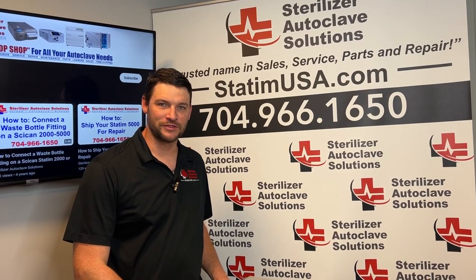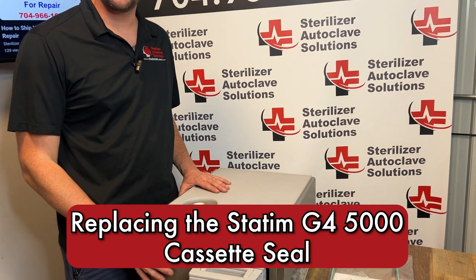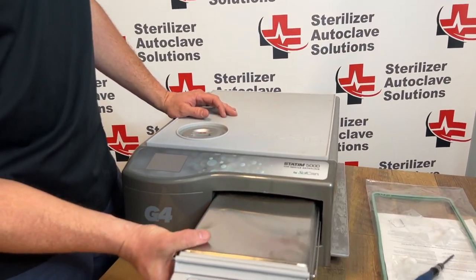Hi, this is Ian with Sterilizer Autoclave Solutions. Today we're going to be changing the cassette seal in a G4 5000. The G4 and the classic are the same.